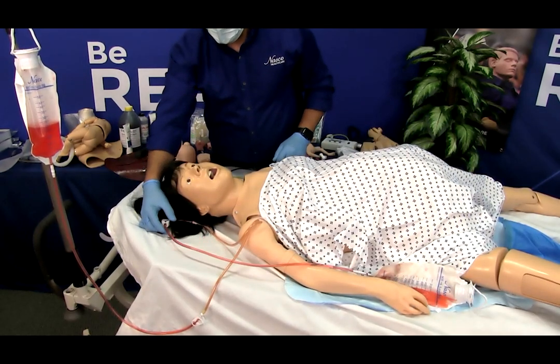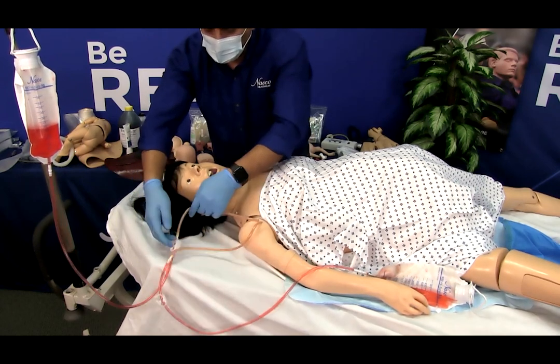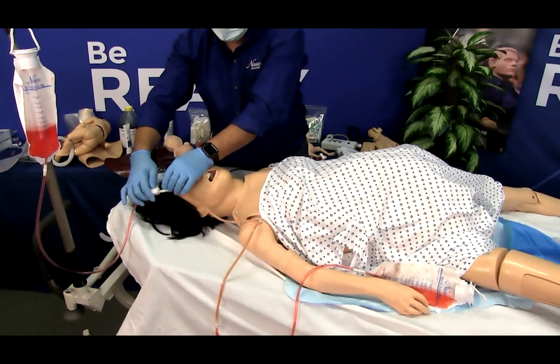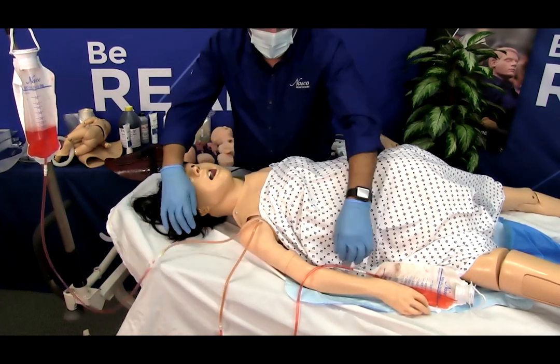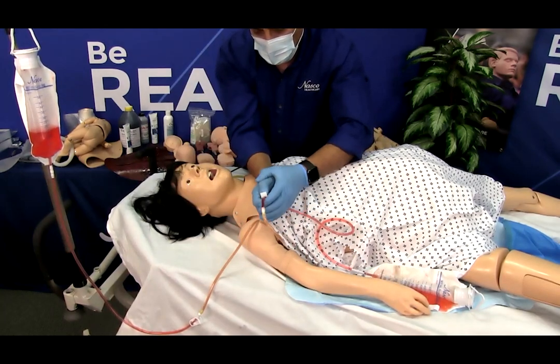Close the clamp on the outlet shoulder tube and, if using an IV bag, close off the blood outlet. The system is now filled and pressurized. Be sure to leave the clamp on IV bag A open. The arm is ready to practice drawing blood. Synthetic blood can be drawn anywhere along the pathway of the vein.